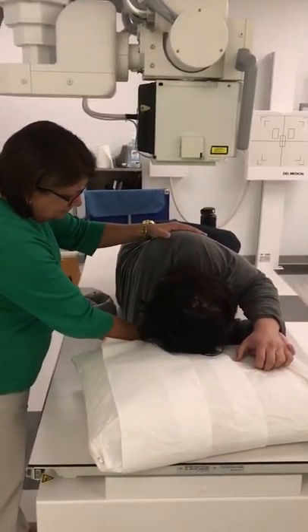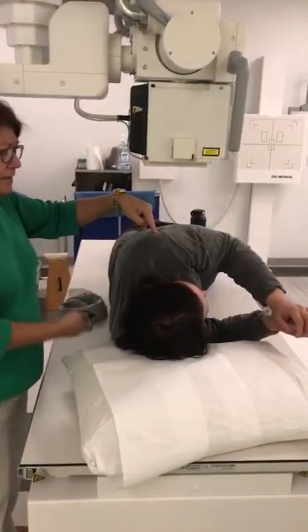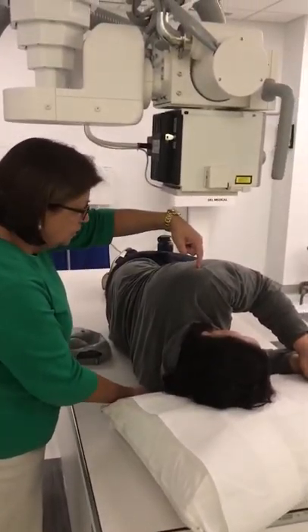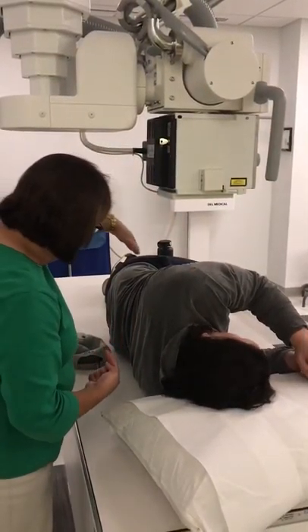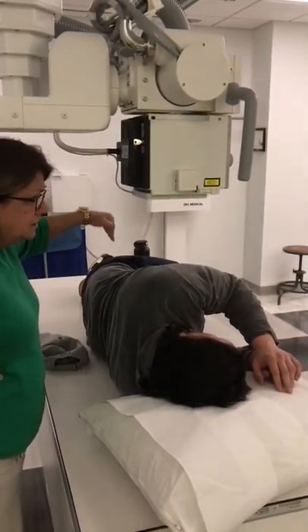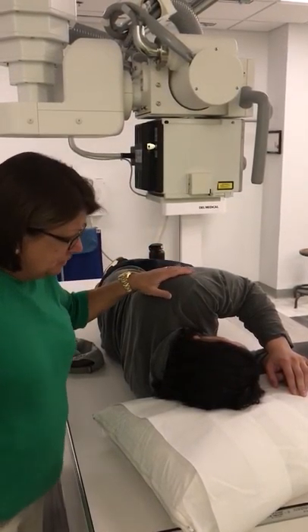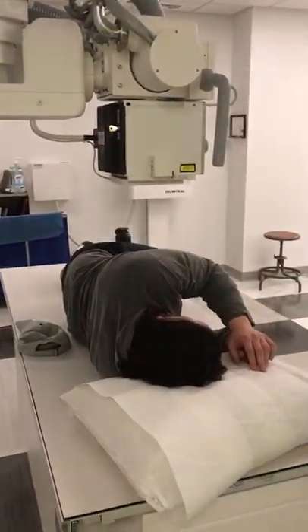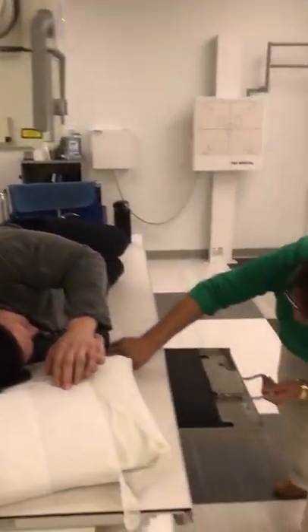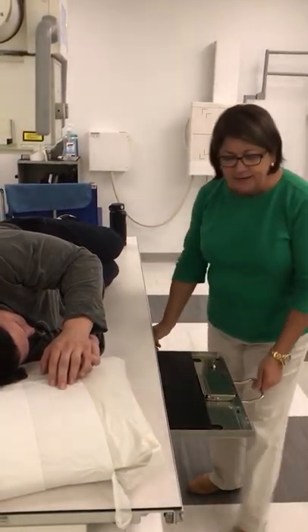I'm going to bring this bottom shoulder back a little bit. I want to visualize those humeral heads superimposed, one over the other. Same with the femoral heads. So those hips need to be in a true lateral, and the shoulders do as well. Check to make sure that our IR is still 2 inches above the shoulders, and it is.